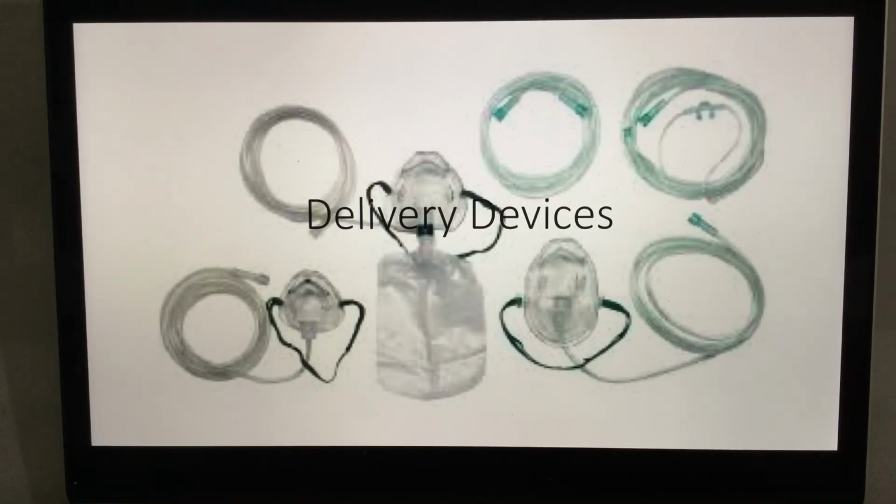in this video slide, this is a pediatric face mask to the non-rebreather. We can switch that out, or you would grab a non-rebreather mask that is more for the adult setting, for your adult patient. But we're trying to keep the bag inflated and that our liter flow rates are at least 10-15 liters and above.